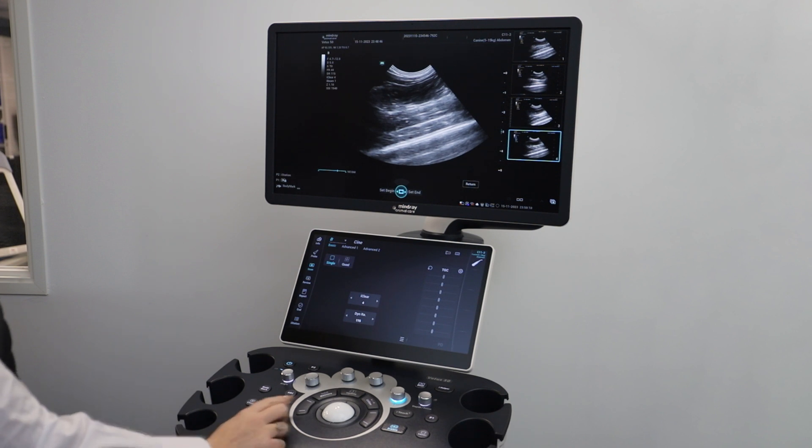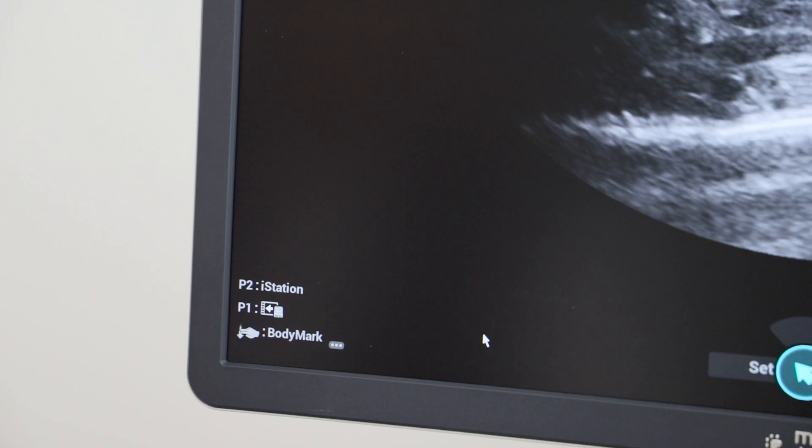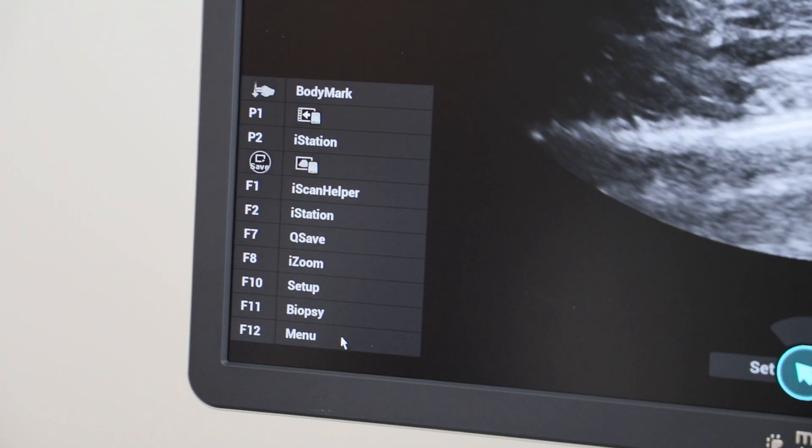There is also the ability to have shortcuts if you want to access more options, as shown here next to P1 and P2 on the screen. To get to the setup mode, I-Scan helper, or to get to the camera or cue save options.